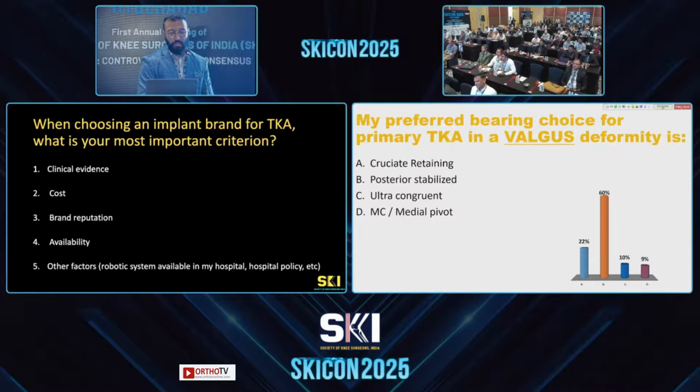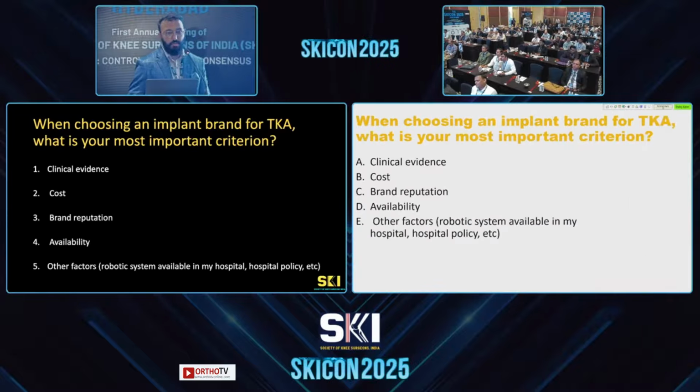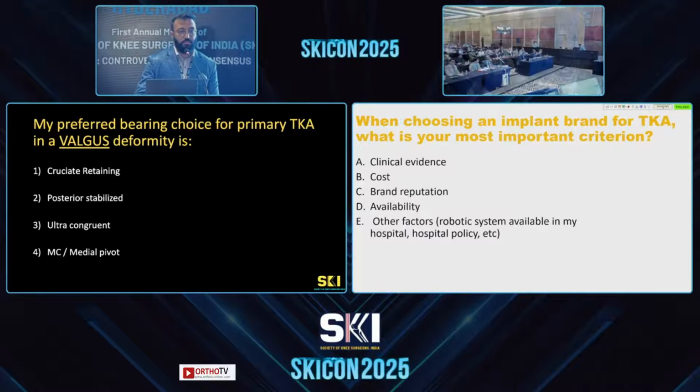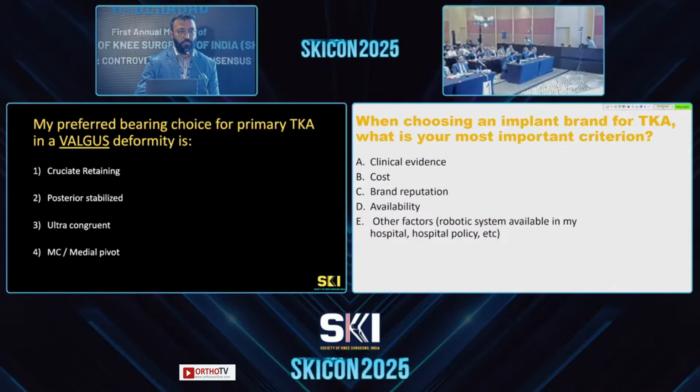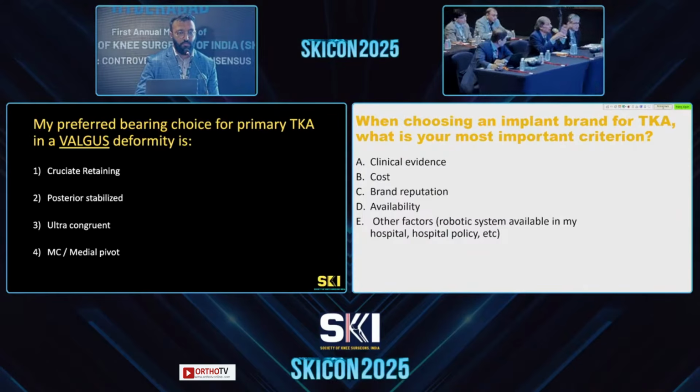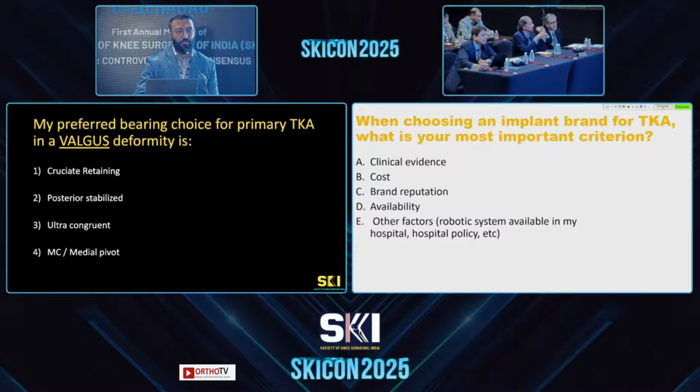The next question is... Just one comment by... Sahil, just to your previous question, medial pivot is a game changer in valgus knees particularly, because it snugs up your medial, which is really where the pathology is. You know, you've got this instability issue. So for valgus knees, our go-to is the medial pivot. Oh, thank you, sir.